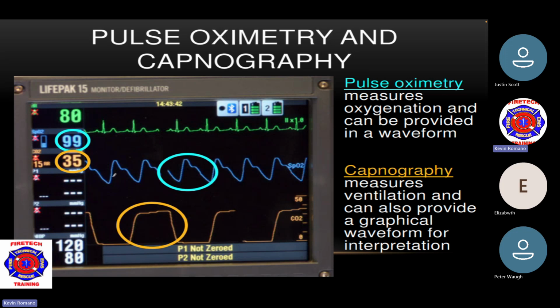What you're seeing here is what they call a pleth. Pleth is the ups and downs of that waveform. If you have a waveform that kind of looks like this, like that, that is not a decent pleth. Therefore, you're not getting an accurate measurement, right?